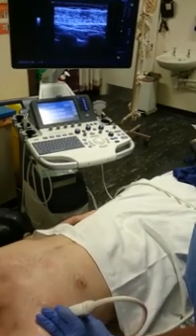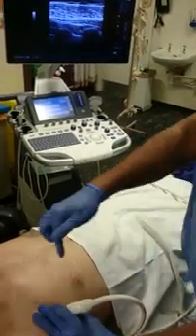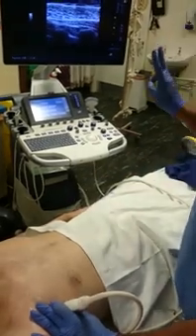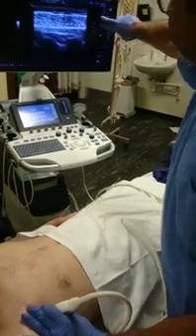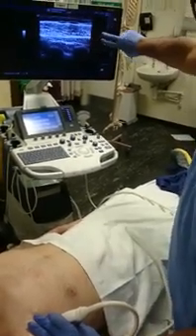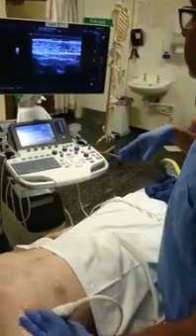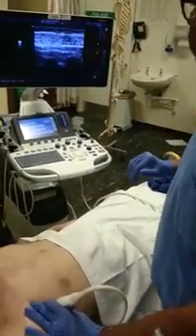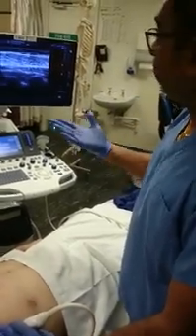In this picture you can see a little bit medial orientation of the probe — you should see two ribs, usually the third and the fourth rib, and you see a tapering end of the pectoralis minor. You can go right up to the corner point where the pectoralis minor meets the pectoralis major and you can do a modified pec block which probably covers both pec 1 and pec 2.